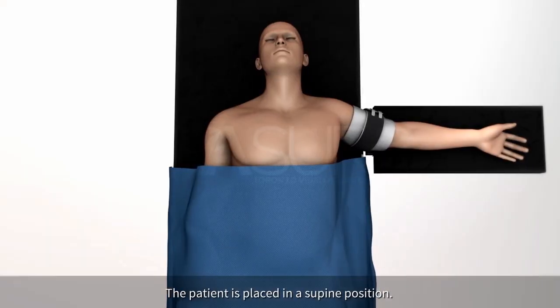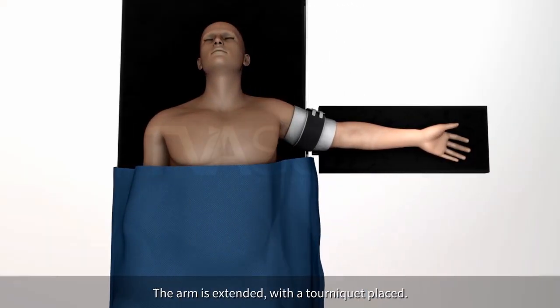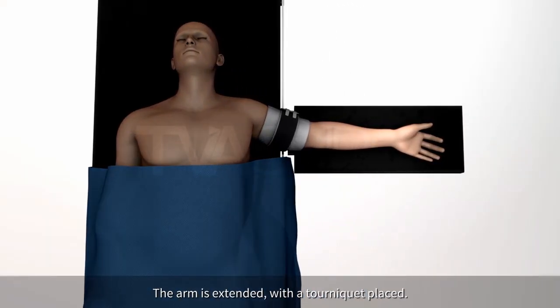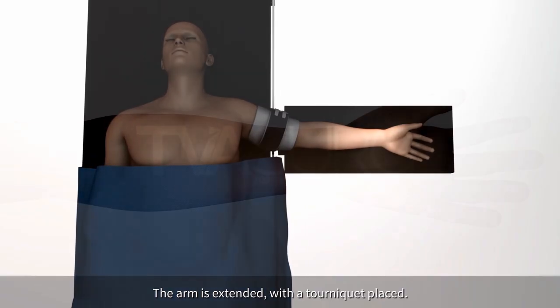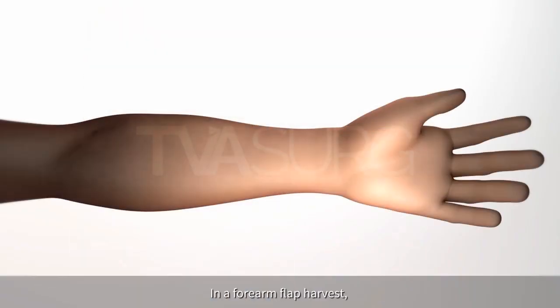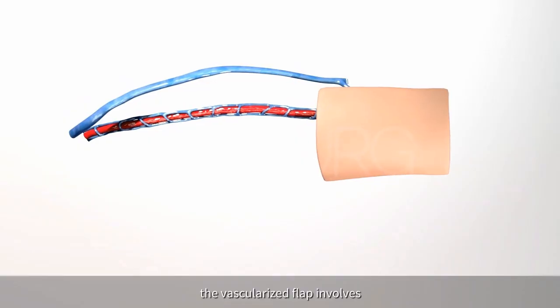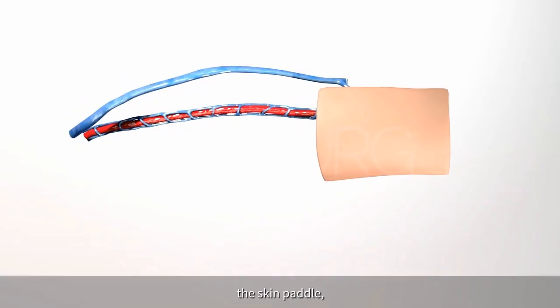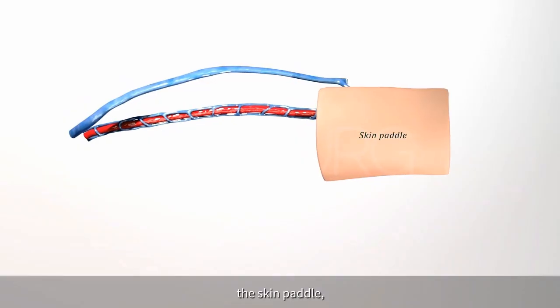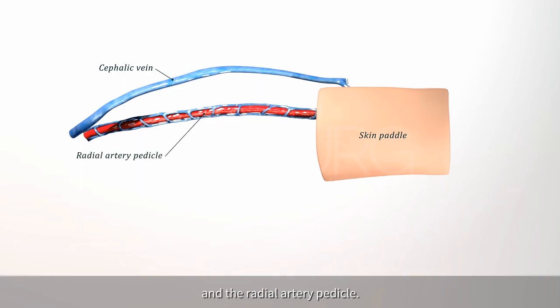The patient is placed in a supine position. The arm is extended, with a tourniquet placed. In a forearm flap harvest, the vascularized flap involves the skin paddle, the cephalic vein, and the radial artery pedicle.